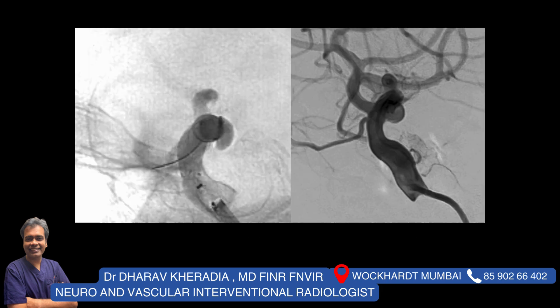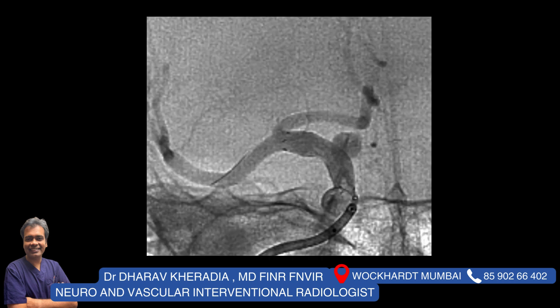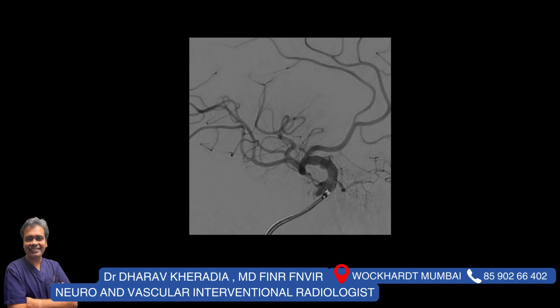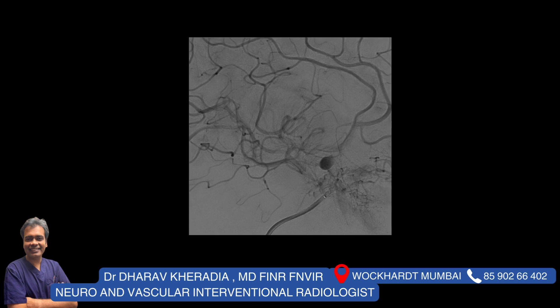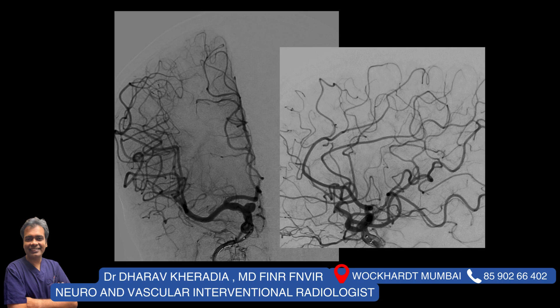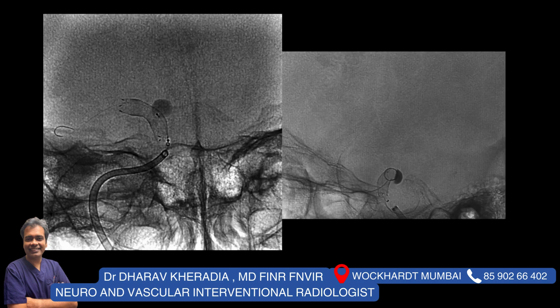This is the flow diverter stent placement — you can see it placed in the parent artery across the aneurysm neck. This is the angiography after flow diverter placement — you can see stasis of contrast inside the aneurysm, which means the flow diverter has already started working. There were no thromboembolic complications at the end of the procedure. You can see nice stasis of contrast inside the aneurysm, confirming the flow diverter is working effectively.